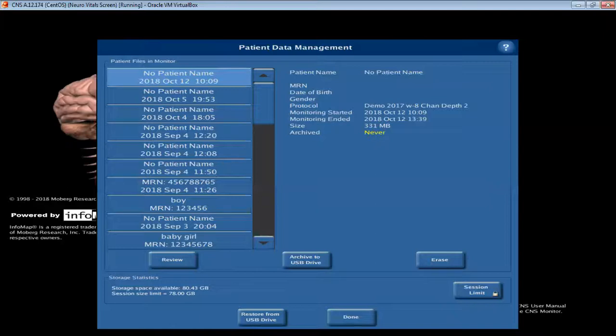And that's fine, but eventually this data storage will get full. So your hospital really does have to have some type of archiving solution, whether it be to offload to thumb drives, but they have to be encrypted and secure, or whether it's archiving to a network solution. So we can actually then just be ready to readmit another patient.